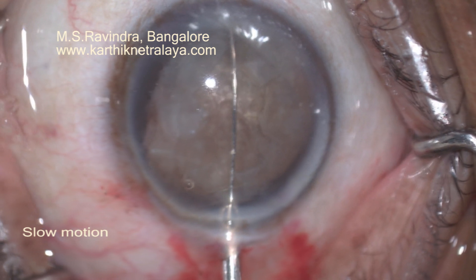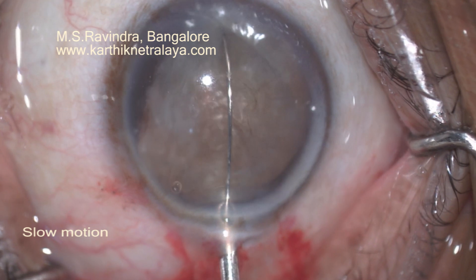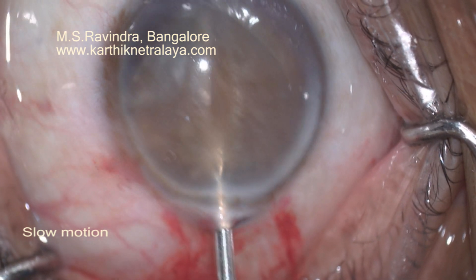I am holding it tight. Now I will start cutting it. Though the nucleus is very hard, whatever may be the hardness, this wire cuts the nucleus extremely easily.